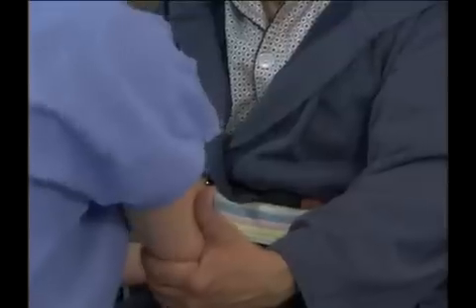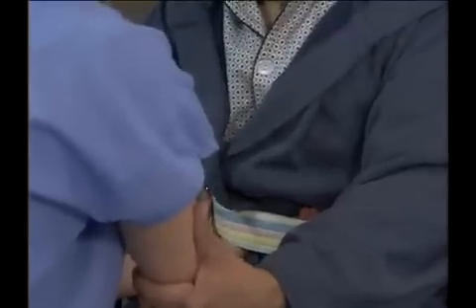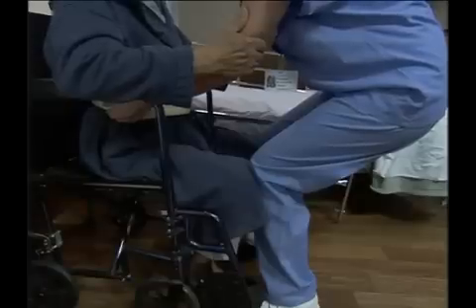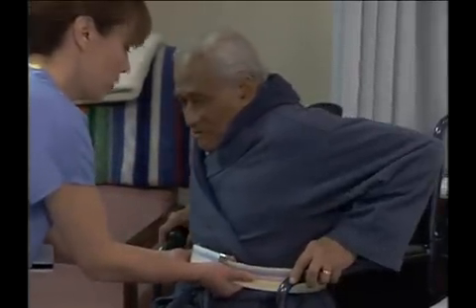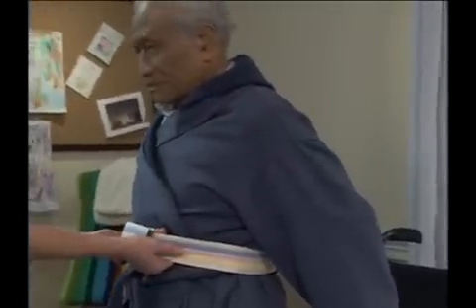Place your shins against the person's shins to block his feet and to keep his knees from buckling as he stands. Have the person rest his hands on your arms and assist him to stand by pulling on the transfer belt as you straighten your knees. If the person requires less assistance, he can place his hands on the wheelchair arms for support and push off while you offer support.